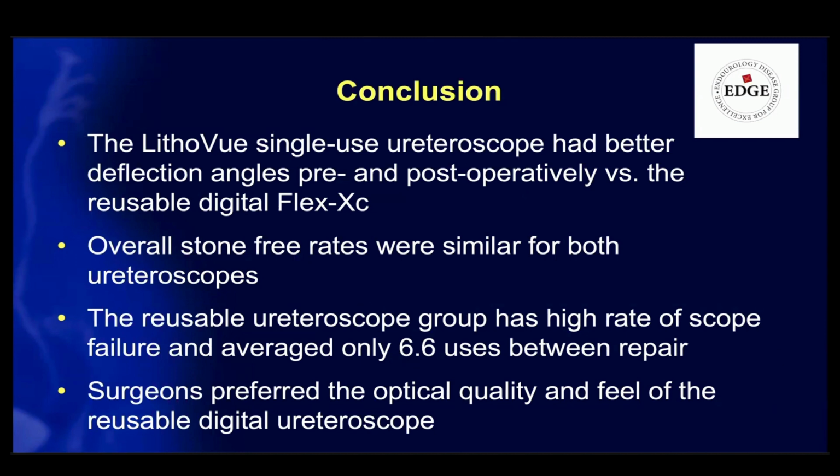Essentially, we got about 6.6 uses between repairs, which is about average from what you see in the literature. So the question is, depending on the cost of your repair, was it more cost efficient to go with the single-use versus the reusable scope?